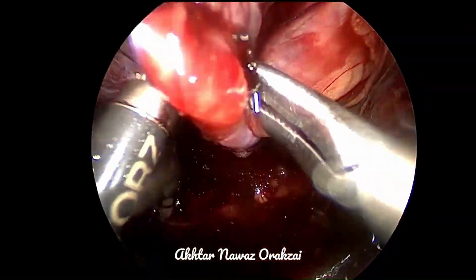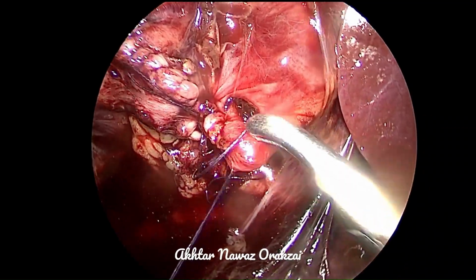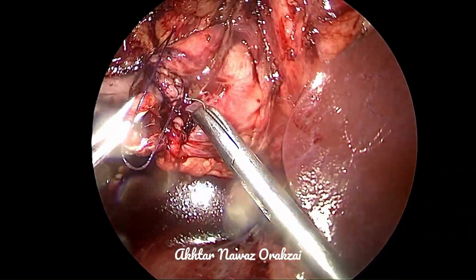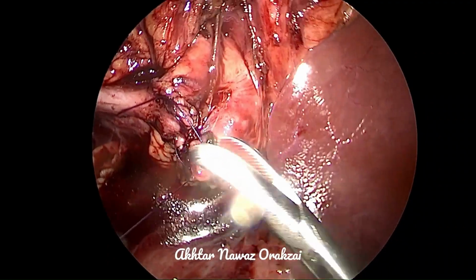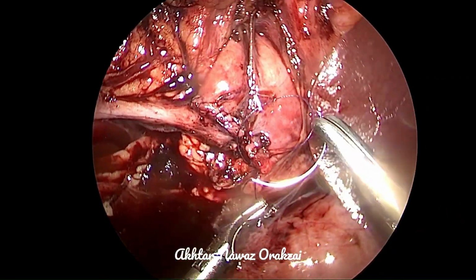Any further mobilization will lead to devascularization. In that case, try to mobilize the pelvis because it draws its supply from the kidney as well. Or you can mobilize the kidney, and in laparoscopic procedure, mobilization of the kidney is easy. So, anastomosis without tension.